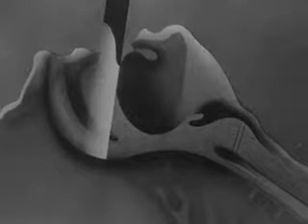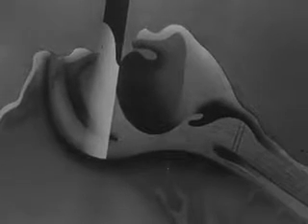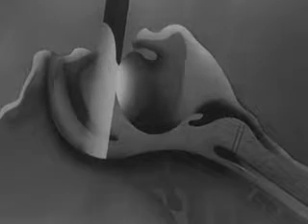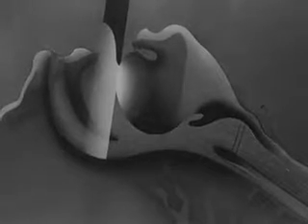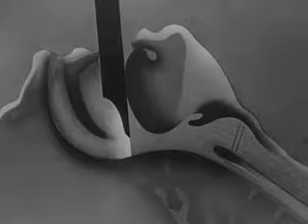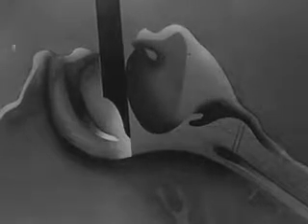First, let us see in this diagram which are the landmarks along the course of the laryngoscope. The first thing to be illuminated is the dorsum of the tongue. The laryngoscope is advanced along the tongue, and when it is advanced about half the distance it must eventually travel, the uvula comes into view.